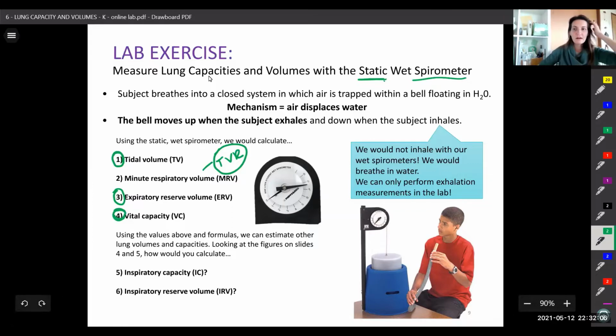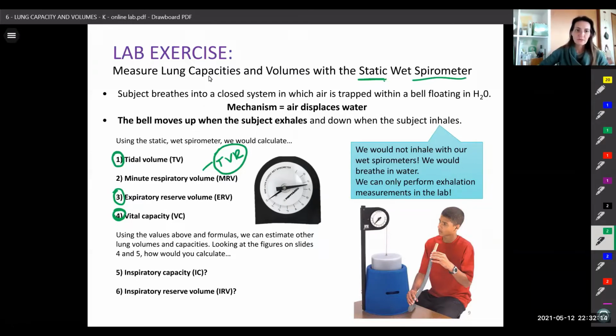We can actually get a vital capacity measurement with the spirometer as well, given that vital capacity is a measurement of how much you can forcibly exhale after a forced inhalation. So you take the biggest breath you can, and then you exhale as much as you can, right? And for the machine, we would be measuring how much you can exhale, right, for that measurement.